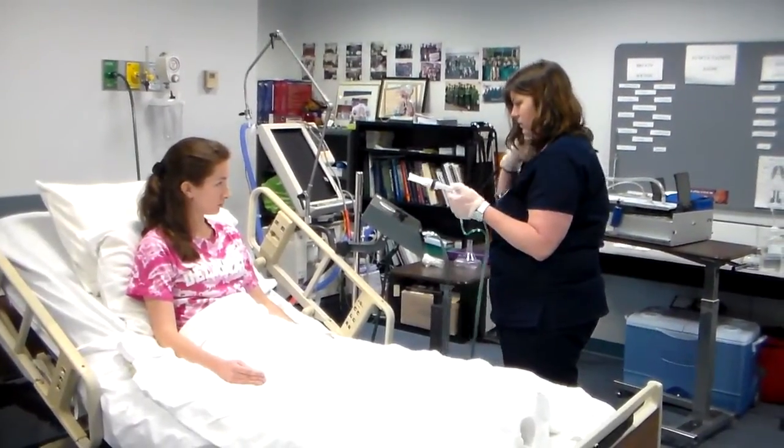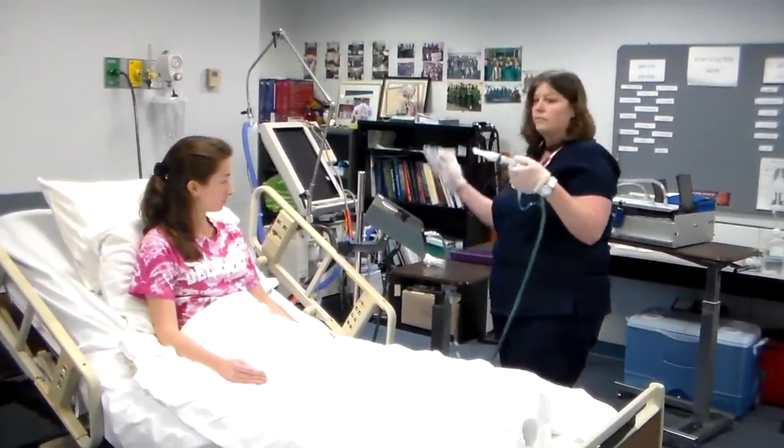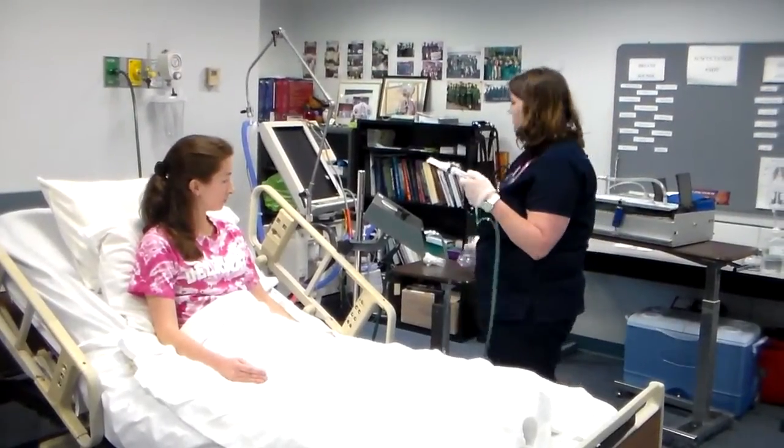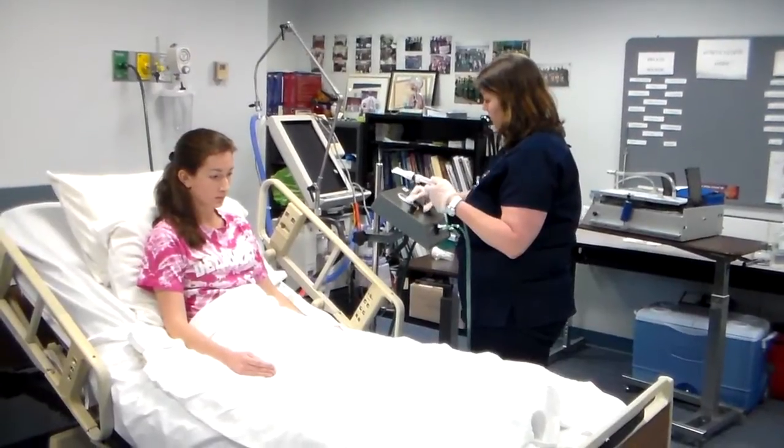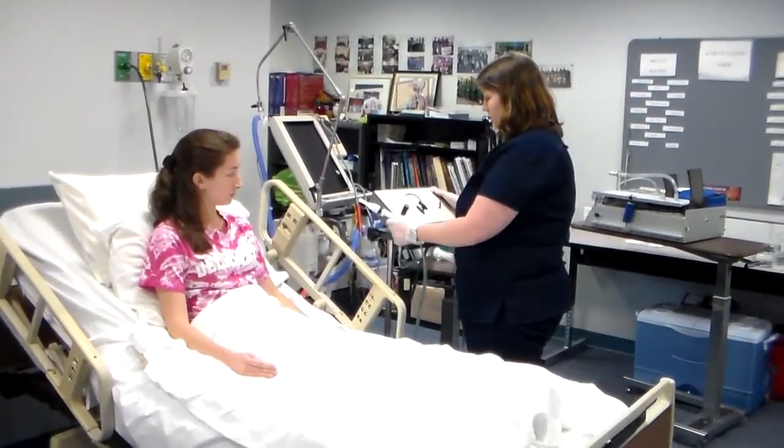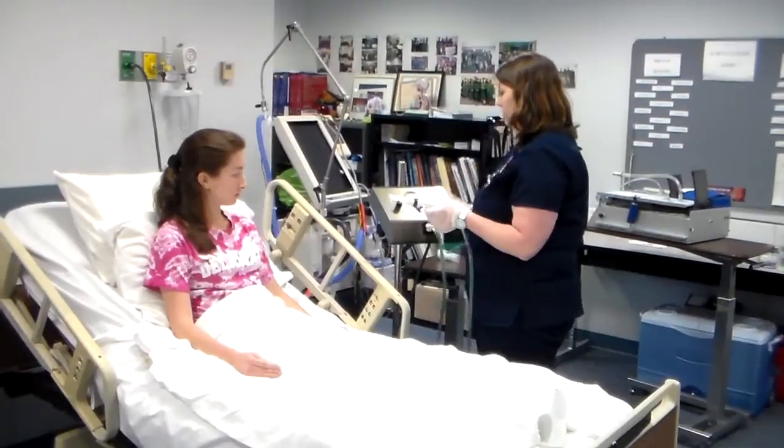A mouthpiece or mask can be attached to the circuit. Assessing your patient is the best way to figure out which piece is most appropriate. Since your patient is awake and alert and oriented, the mouthpiece will be used for the treatment.